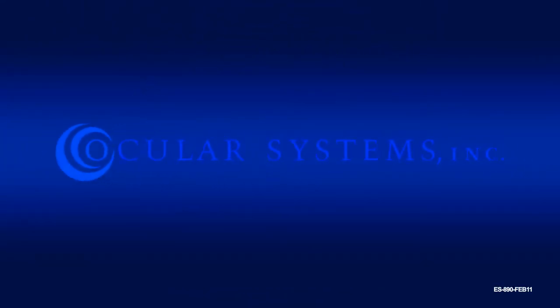Welcome to the instructional video on the use of the Endosurter Corneal Endothelium Delivery Instrument.